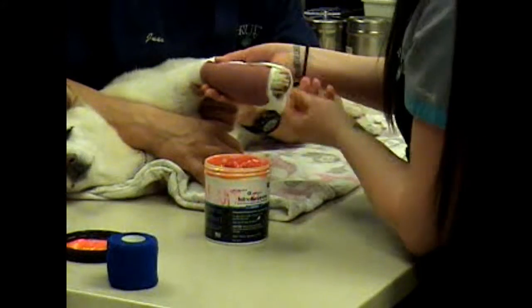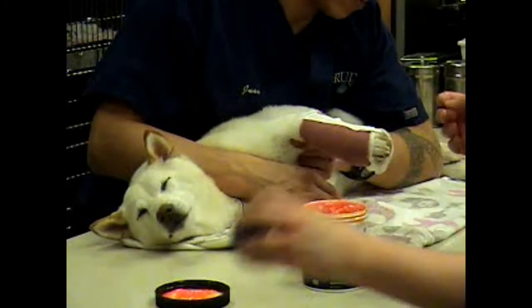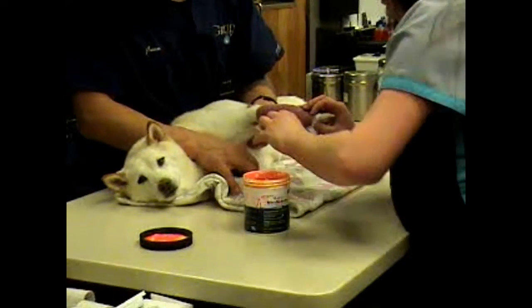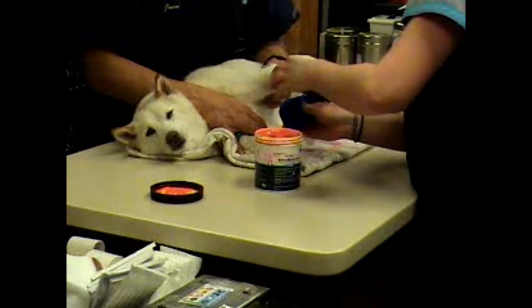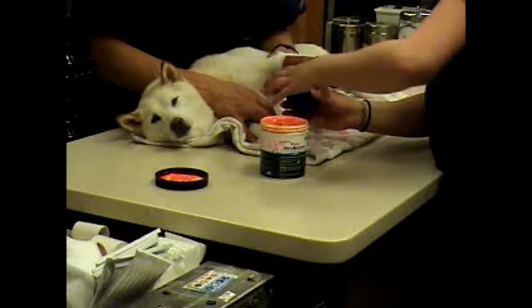You can see our 3x3 sticking out a little bit, so we'll just push that in. Then we're going to take Vet Wrap just as a protective layer and just kind of cut it around the bottom. This one tends to get a little too tight if you don't unravel it a little bit before you start, so I like to pull it out a little bit and then start to wrap it around.